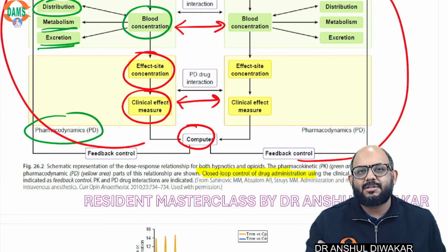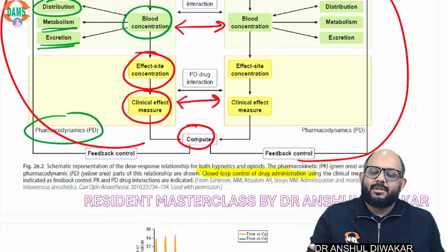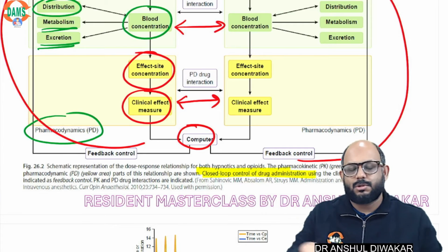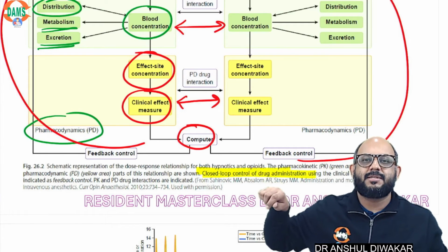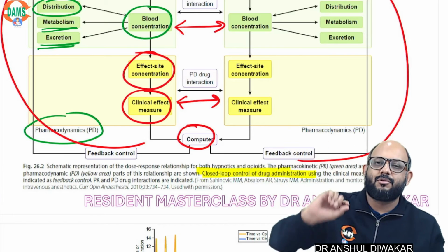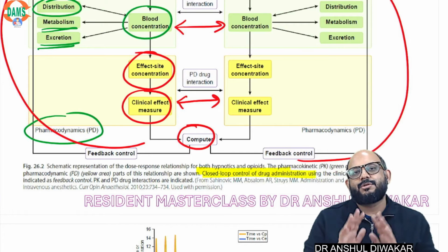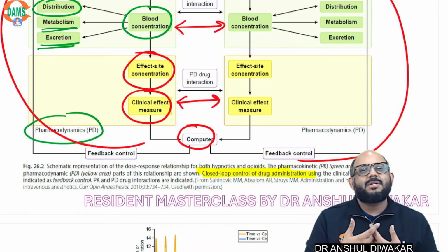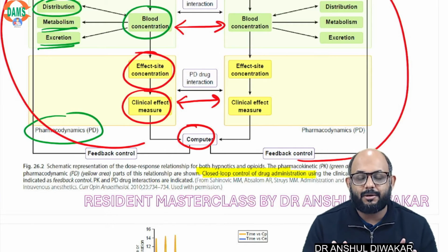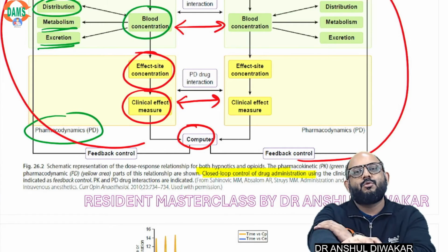When you are giving normal anesthesia, you do that by controlling the dial on the vaporizer, isn't it? So the surgery is going on, suddenly the surgeon gives a longer incision. Suppose it's an open surgery going on, again the surgeon extends the incision. Suddenly you will see hypertension, tachycardia, and if you have BIS monitoring, you will see the values are rising. You will increase the dose. Again, if nothing is happening, the surgeon is closing up, you have given a good epidural, towards the end of the surgery you are practically giving no inhaled anesthetic agent, and still the patient is very, very comfortable, right? So you have to understand that this is what you normally do, and you are the person who is judging it.